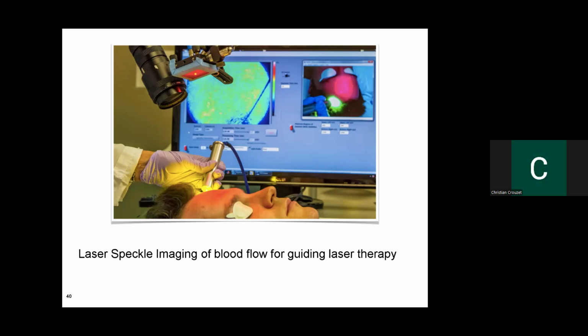And it's really a visual assessment. Does this look like the skin turns more purple, which would correspond to shutting down the blood vessels? So there really wasn't a functional measurement. And that's where experience from the treating physician is really important. Dr. Nelson is really good at this because he has so much experience with it. But you couldn't take an average Joe and say, here's a device, start treating them, because they don't have that clinical knowledge of when the therapy would be sufficient.